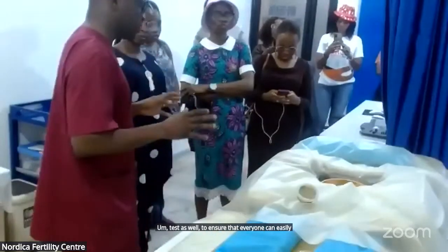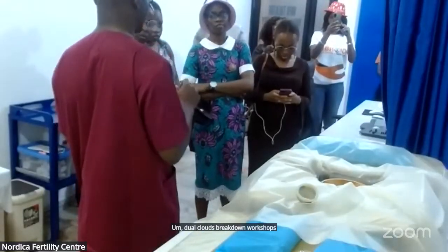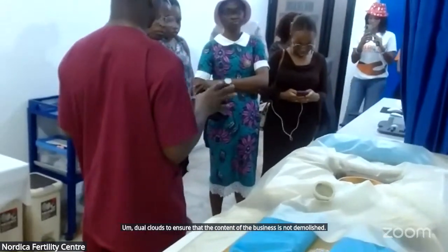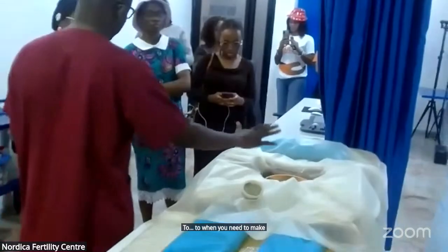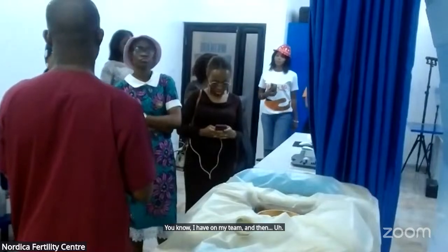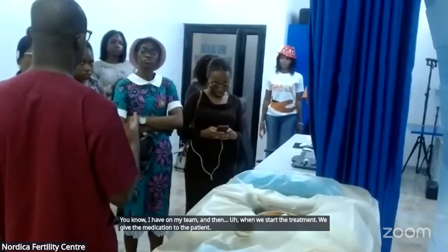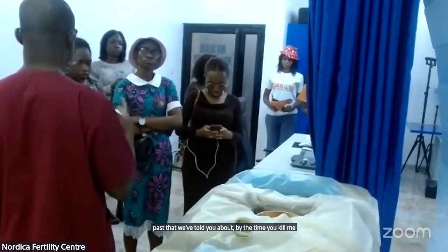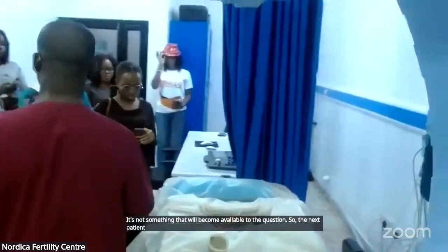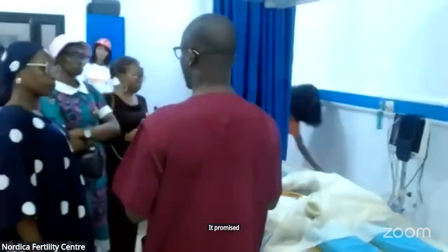And on the day of treatment too, we do what we call rectal washout to ensure that the content of the intestine is not much, to prevent any injury to the intestine. And then we ask the patient to lie on the machine, and then we start the treatment. We give medication to ensure that the cramps that we talked about at the time we kill the fibroid do not become unbearable to the patient. So the medication helps us to manage the cramps that usually occur while we kill the fibroid.